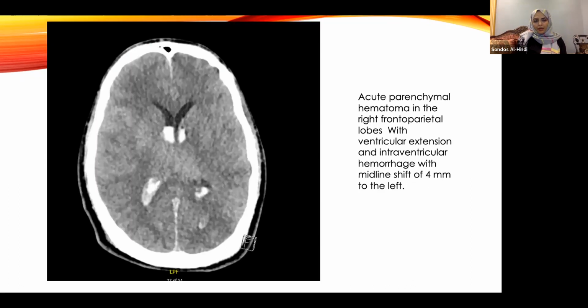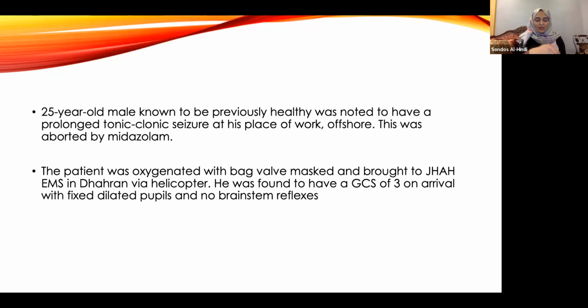For some reason his EEG epoch is not here, but he had the most unfortunate, textbook EEG of brain death in terms of montage, literally a flat EEG. No underlying small activity, no beta activity ongoing, even with increased sensitivity. Unfortunately this patient was declared brain dead and died.